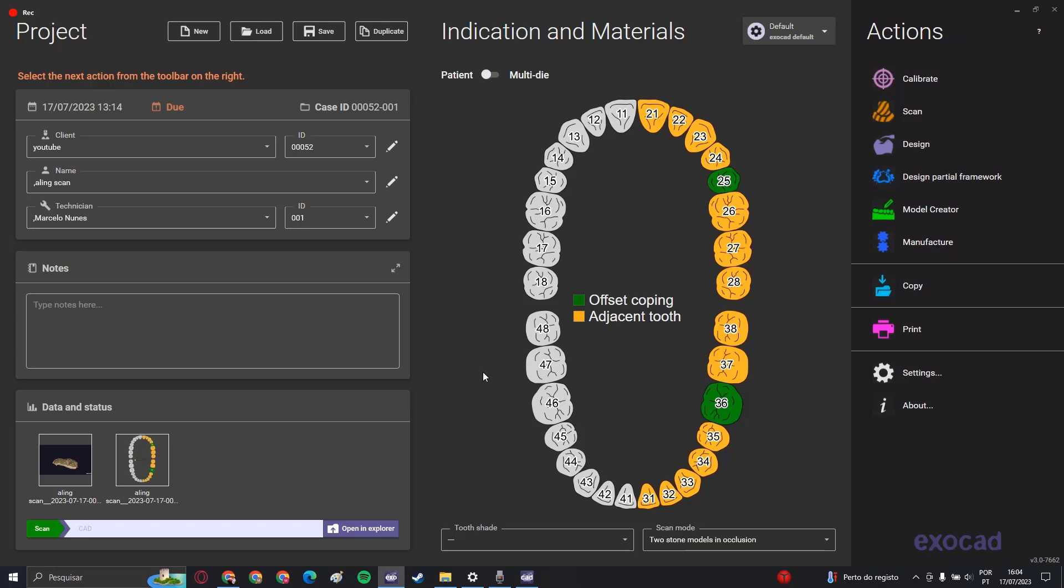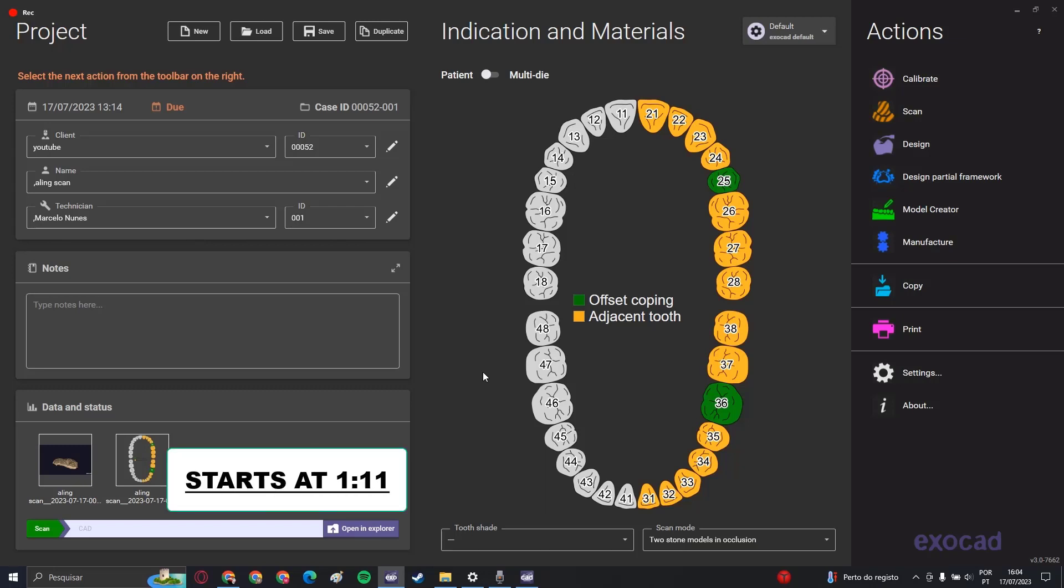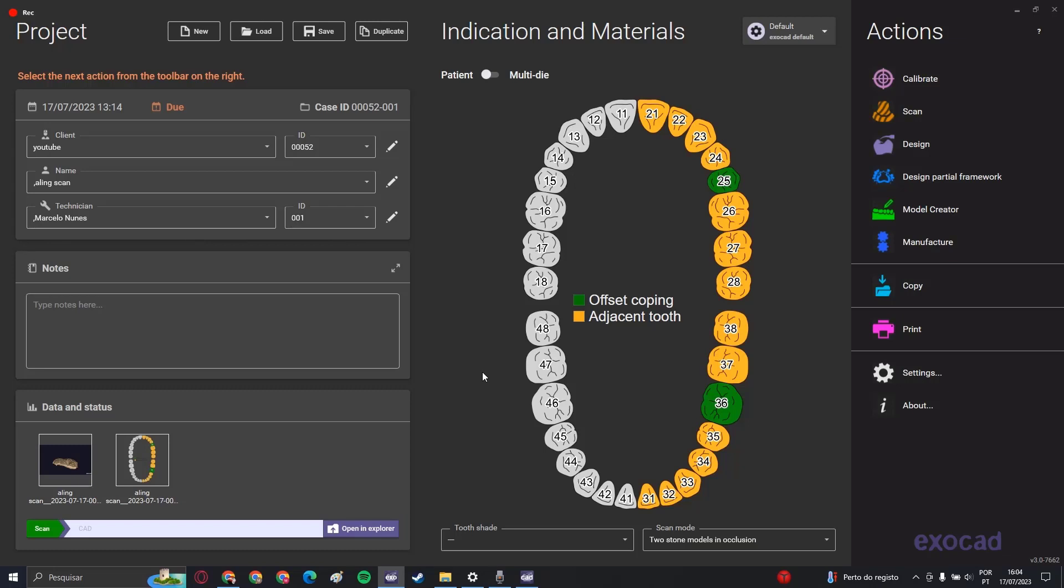If you work already with Exocad, you know that sometimes the clinics don't send the scans in the proper occlusion. This is the reason why we ask for bite scans, so that we can put the individual arch in the right position to make the work.